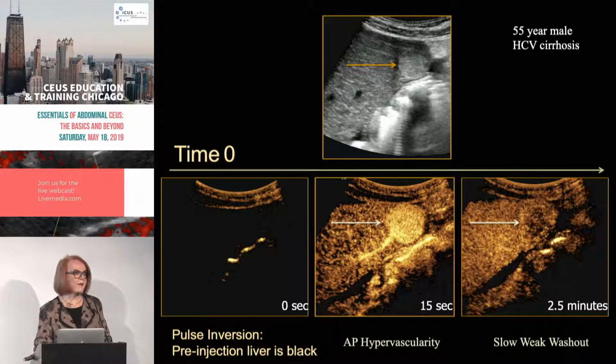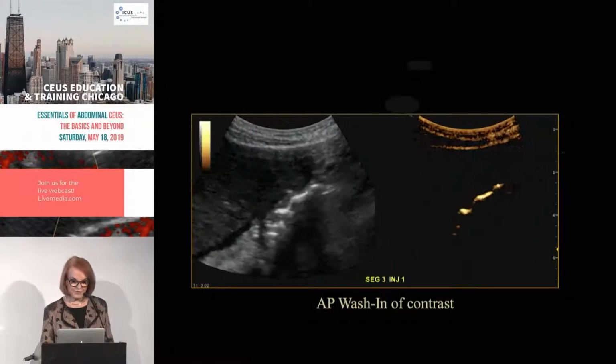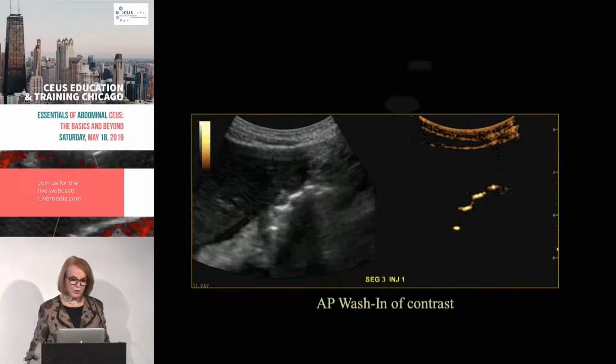And at 2.5 minutes, so that's regarded as late phase, we can see that the mass is again washed out. It's less than the liver. So that gives us tremendous information that's very specific to the diagnosis of hepatocellular carcinoma. Classic enhancement for HCC.